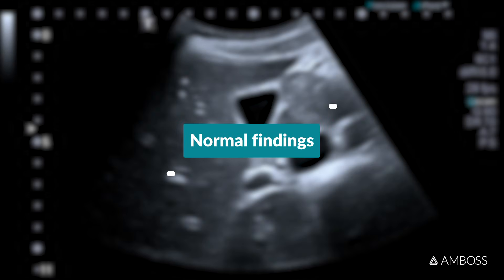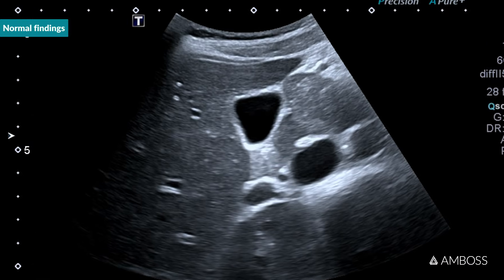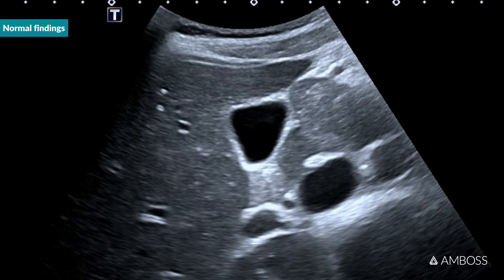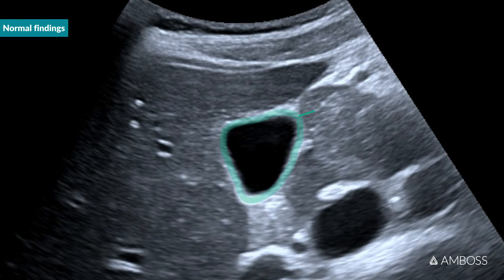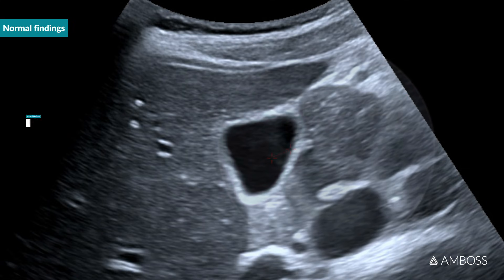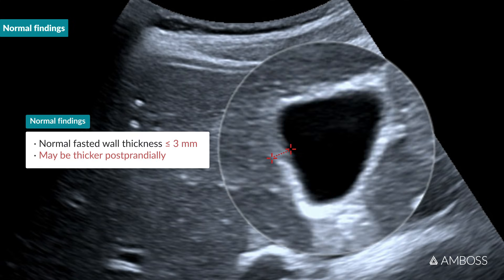Normal findings. A normal gallbladder wall should appear as a narrow, sharply demarcated hyperechoic line. In a fasted patient with a full gallbladder, the wall should be at most 3 millimeters thick. In a postprandial patient, the wall often appears thicker — don't mistake this for a pathological finding.